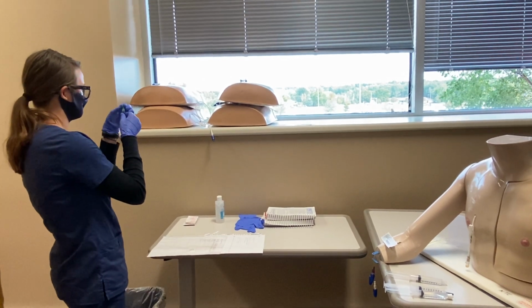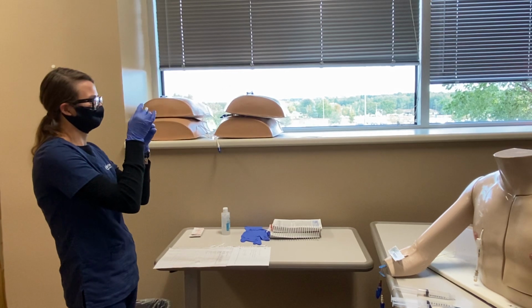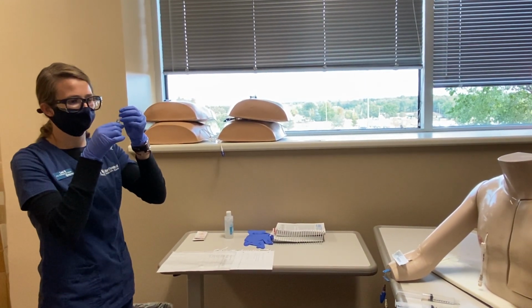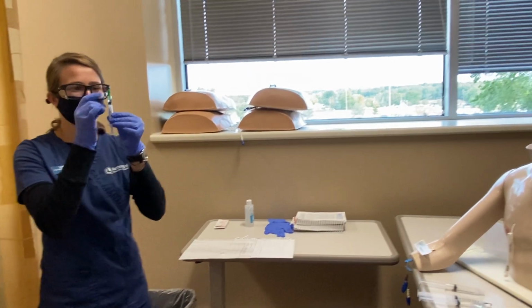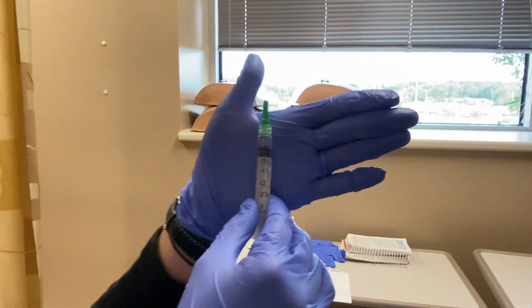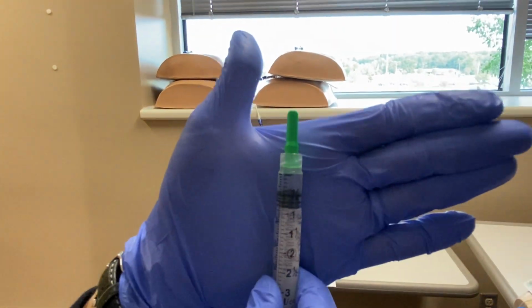There's one air bubble in here that does not want to get out. Okay. So if there is still the little air bubble in there, it would not be if I was going to administer it.